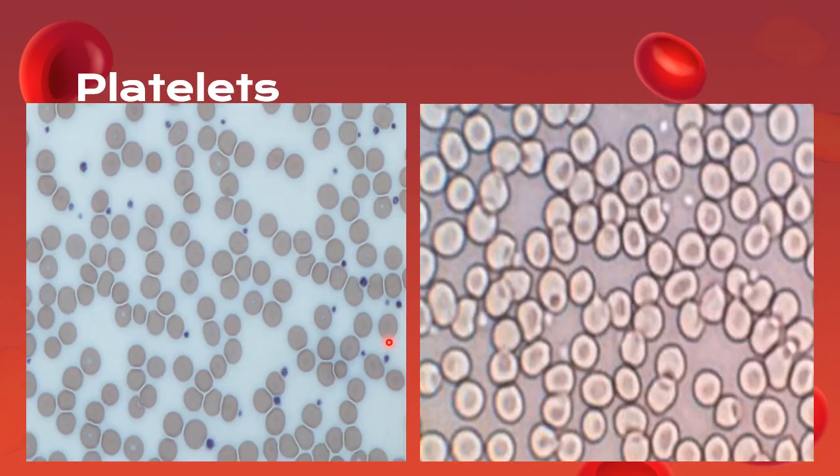So yun yung itsura ng platelets natin. There. Ito yung stained, ito yung unstained. Okay? So, yung unstained, ayan, yung mga puting bilog. Okay? So, yung platelets po, mas madali siyang i-view kapag unstained. Why? Kasi, yung alikabok, mga dumi-dumi, nai-stain din kasi siya ng ating stain, and nagmumukha siyang platelets. Okay? So, kapag unstained yung smear like this one, hindi mo makikita yung mga alikabok, yung mga ganyan. Kung ano yung puting makikita mo, yan, this one, ito, sure ka na platelets yun. Okay?